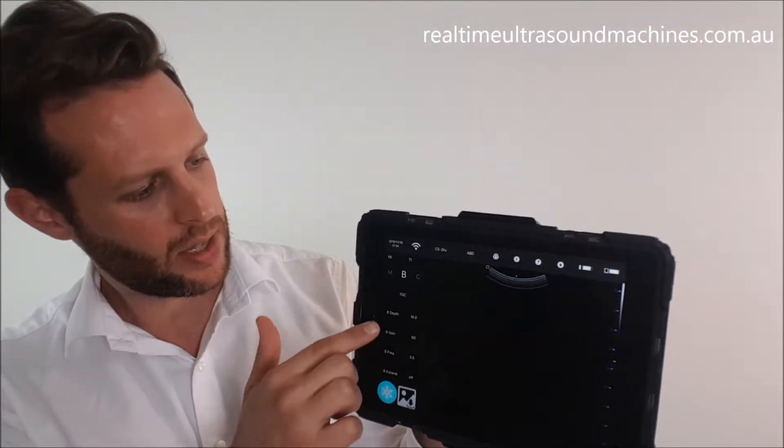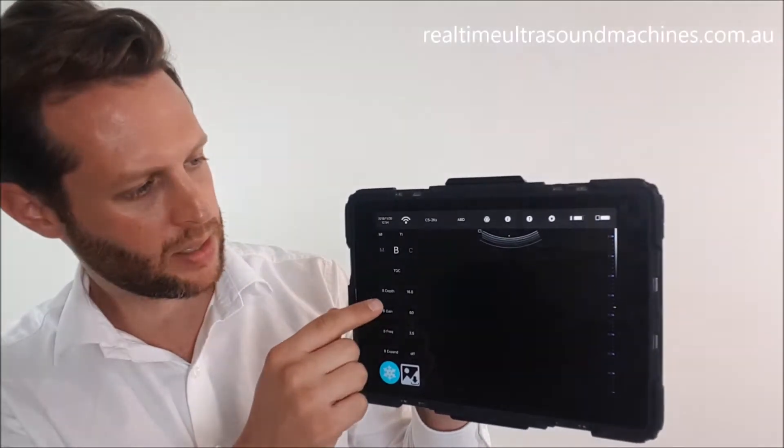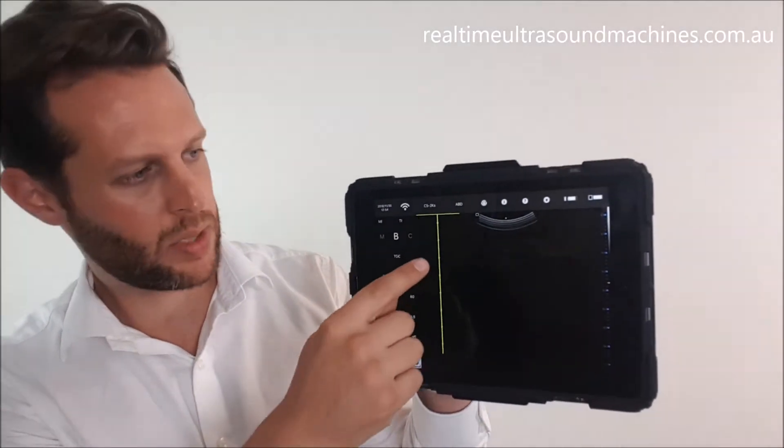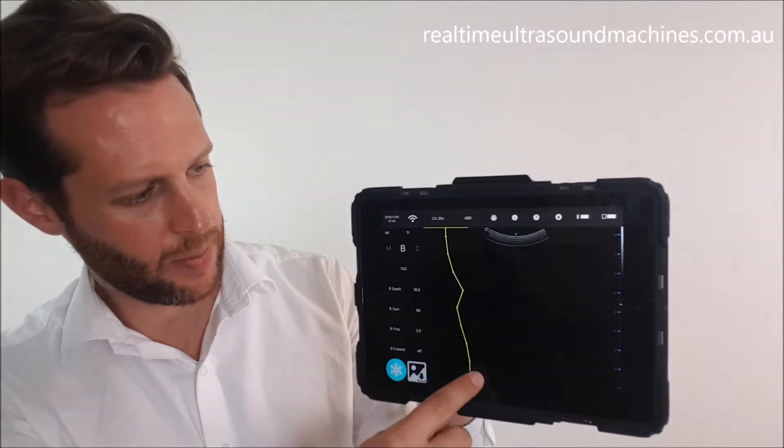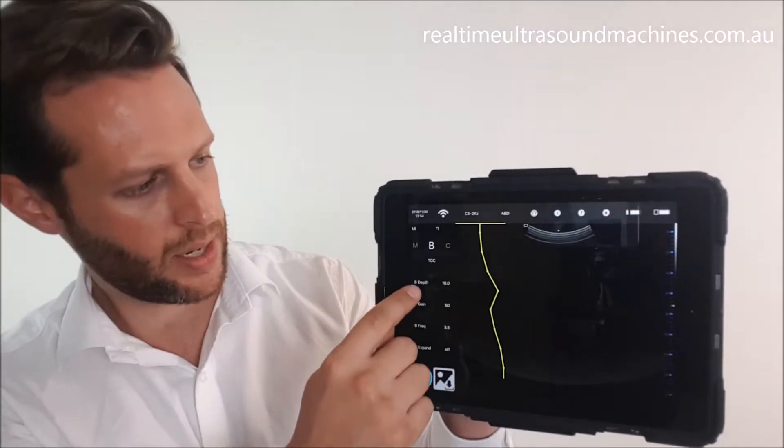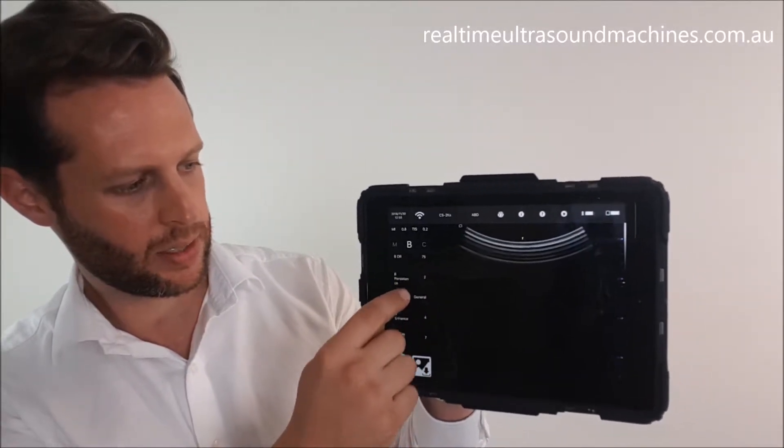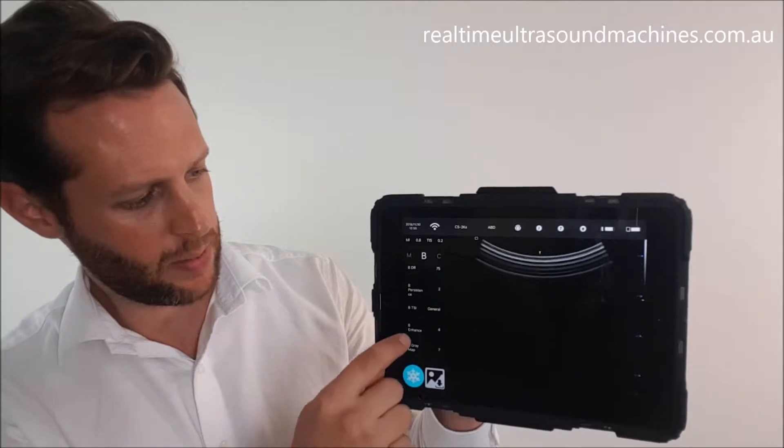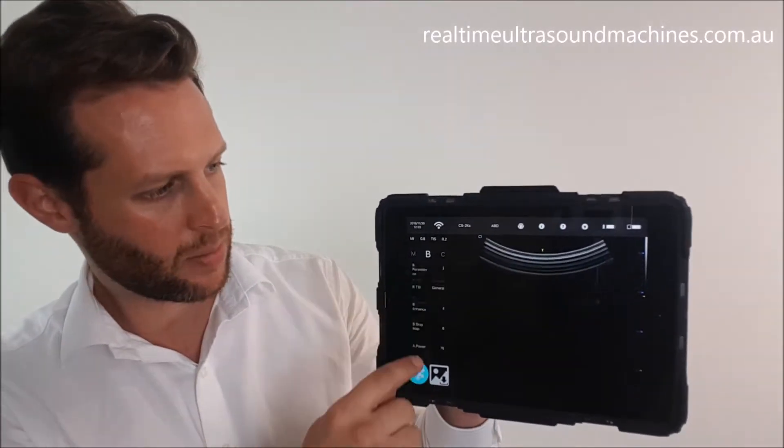On the left-hand side of the screen, you've got all your image optimization menus. You've got things like the TGC sliders, which you can adjust using your touchscreen, and the depth, which you can adjust by sliding your finger right or left. You've got other things like gain, frequency, expand mode, dynamic range, and so on - all these different image optimization parameters.